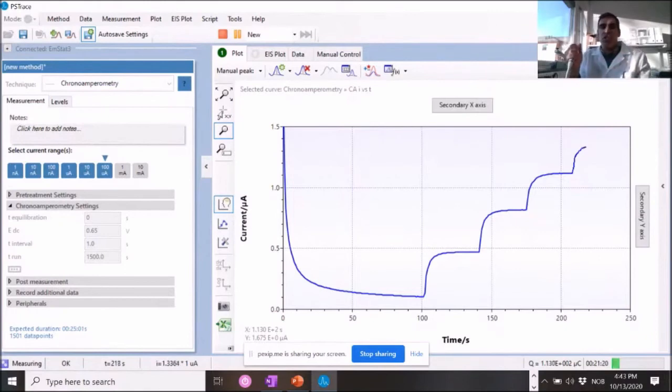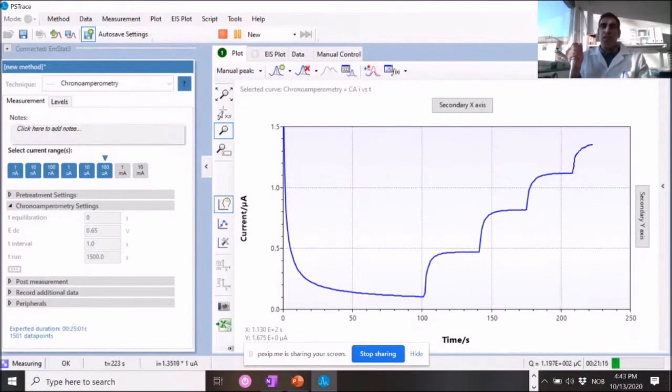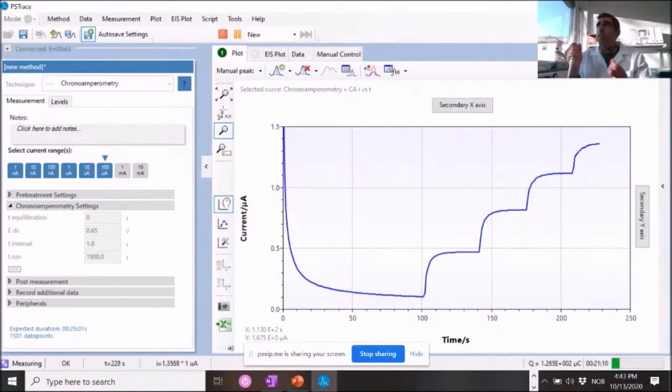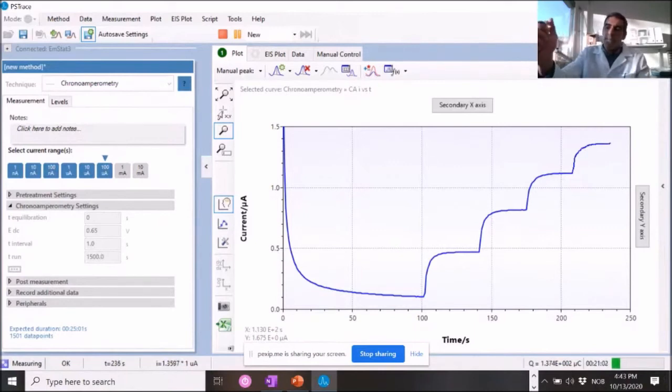So we average the current for each step. And then we do a curve fitting, a linear curve fitting based on actually current density that we record.